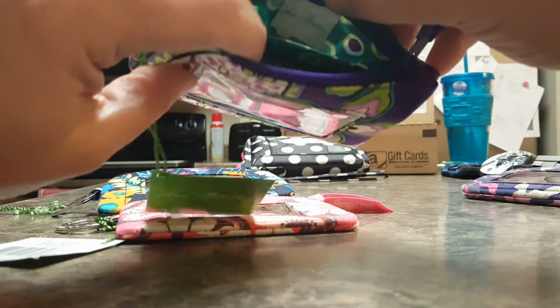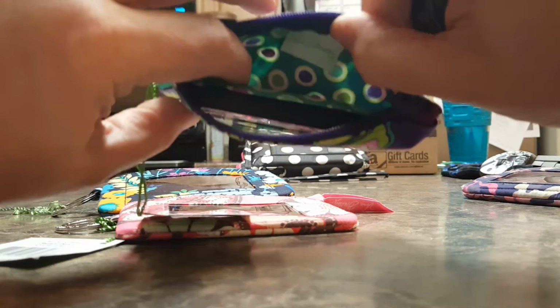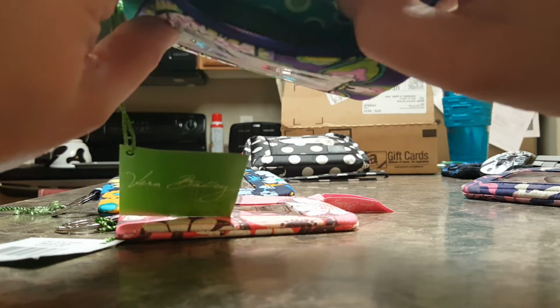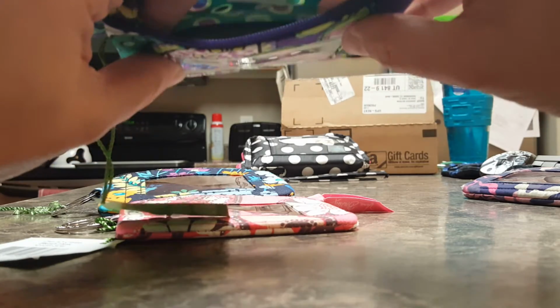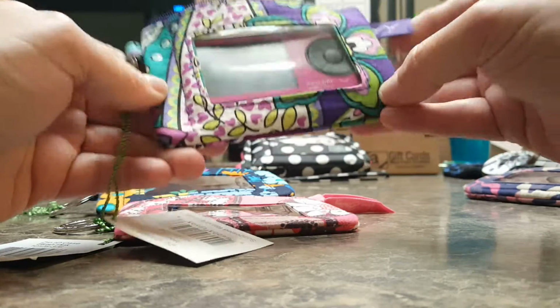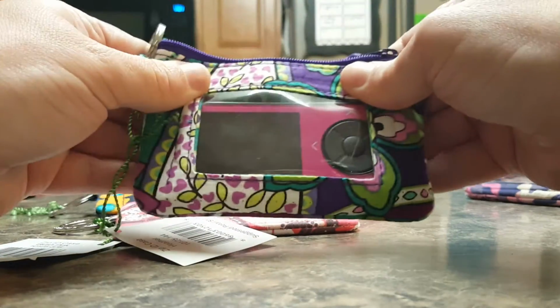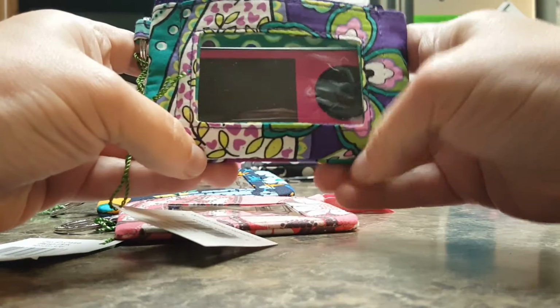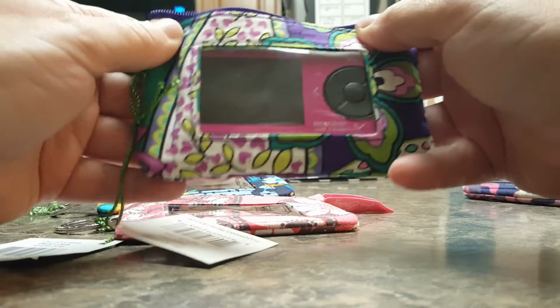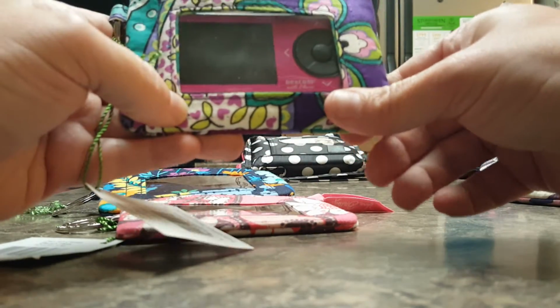And you have the space for your Dexcom, and you have a great little space for your keys or your glucose tabs or whatever, and your Dexcom's not going to get damaged or dirty. And we like it. On this case, I took out a side seam and a bottom seam, and I don't like it as much because it has a tendency to fall down in there, and there's lots of space. I really like it to be nicely centered. So if you don't take out this bottom seam, it stays nice and centered.